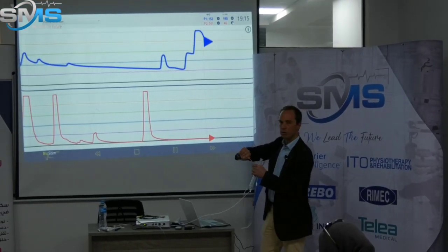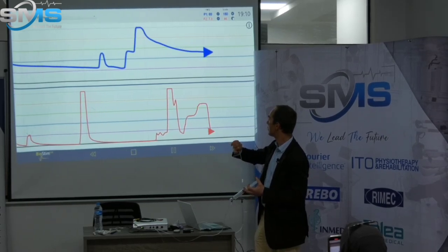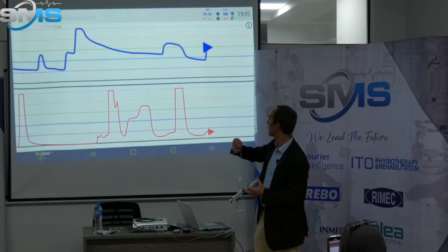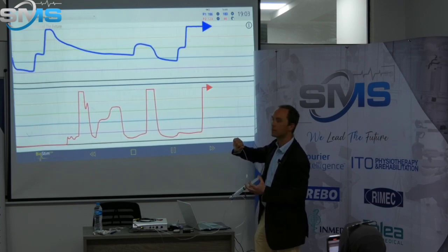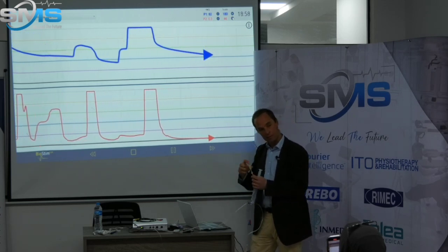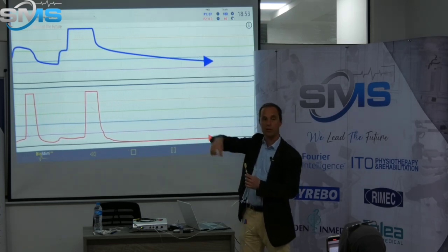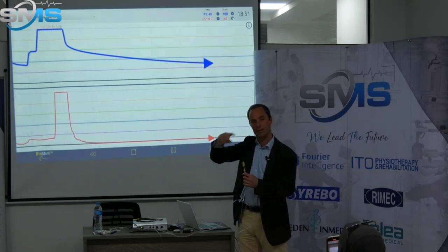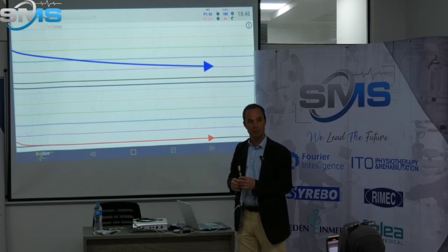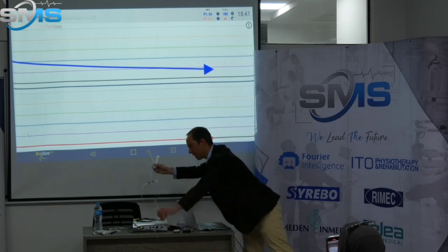So you will tell your patient, when you see the blue line going up, contract. You see the blue line going up because you inflate, contract. After some time, he will feel it. At first, he's only doing it because he sees a blue line. But by repeating it, it will get inside, he will feel the reflex, and the reflex will be automatic. It's quite long, but with this probe you can do this kind of rehabilitation also.